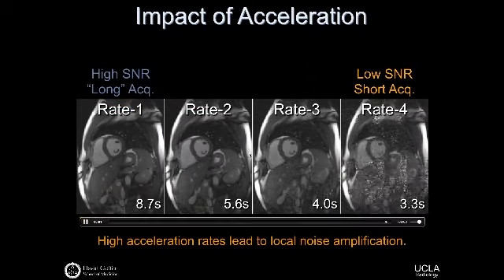And so here are some cardiac images. I show a lot of cardiac images because we do a lot of cardiac imaging. And the acquisition times are as follows: 8 seconds down to, say, 3 seconds.